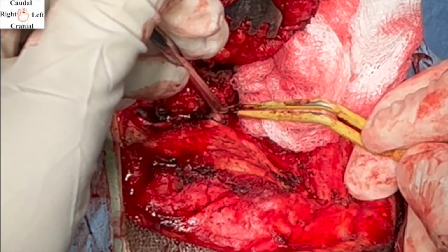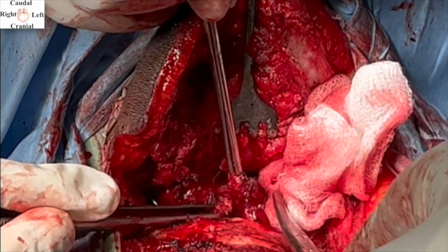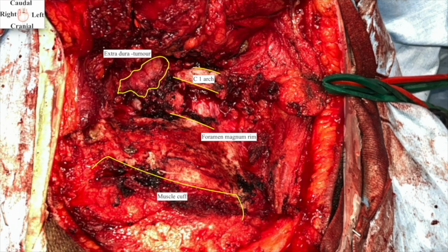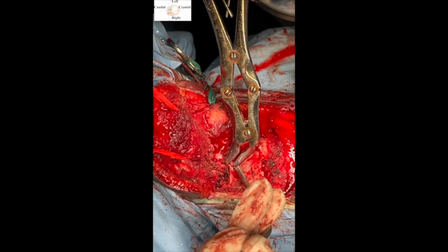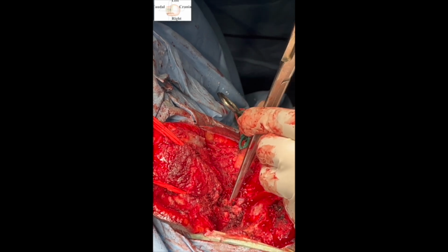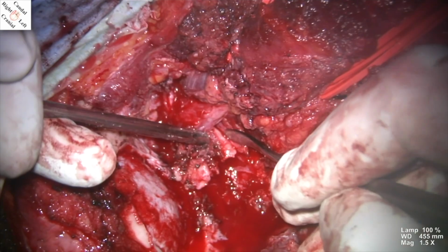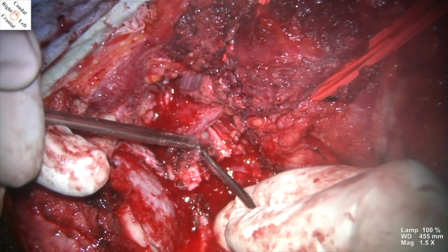The extradural component of the tumor was excised and sent for frozen section. Portion of the tumor that was encasing the V3 segment of right vertebral artery was intentionally left in situ and right suboccipital craniotomy was performed. The posterior arch of C1 was nibbled using Kerrison rongeur and subperiosteal dissection was carried out along the dorsal surface of C1 arch and continued along the sulcus arteriosus.